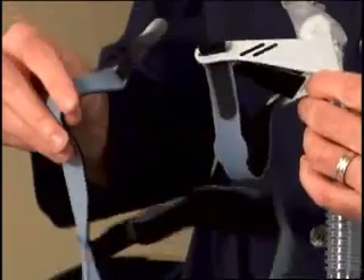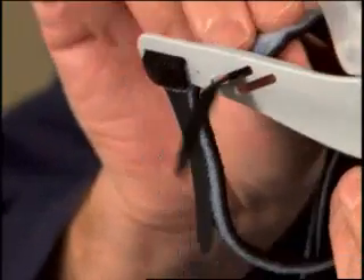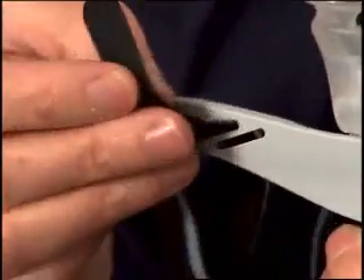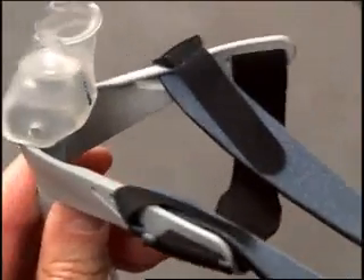Using the corresponding slot on the other side of the interface, insert and attach the black tab the same way. Note that the interface has two slots on either side. It is important that the headgear is attached to the same slot on each side.